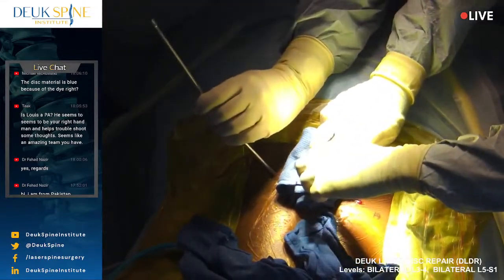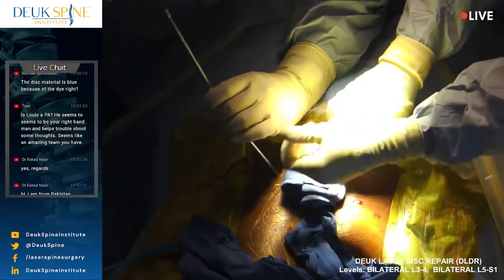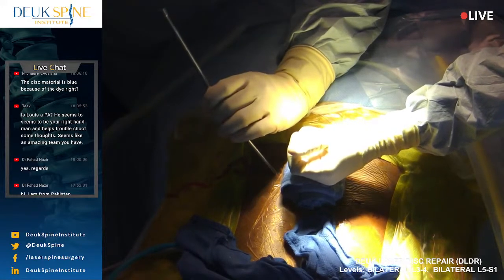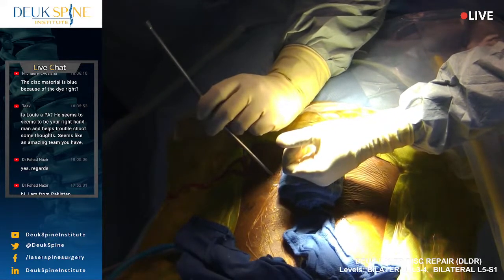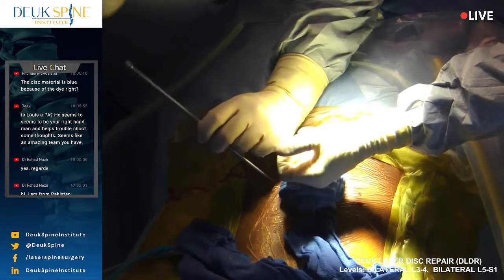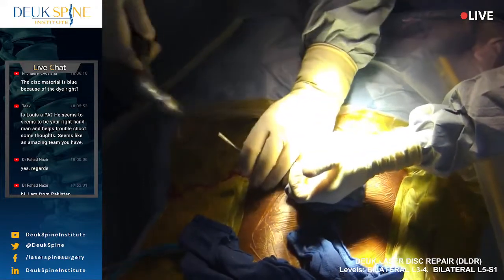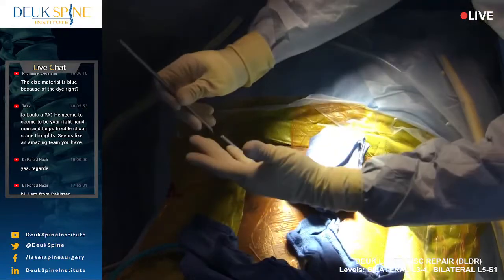Shot. You're still way off on the wag. Shot. Shot. Shot. Shot. That's the last shot? Yeah, go.